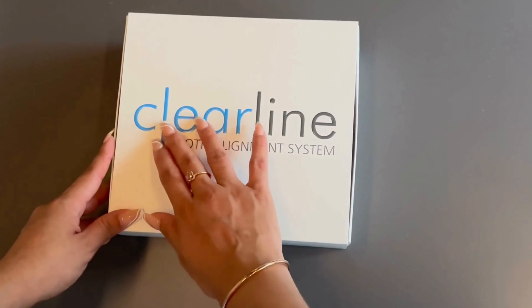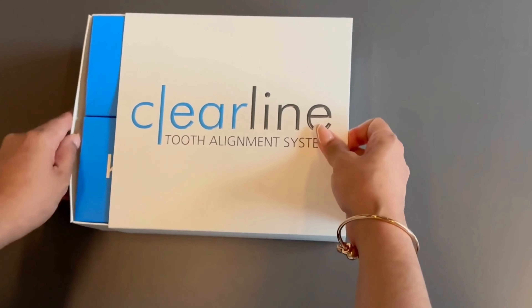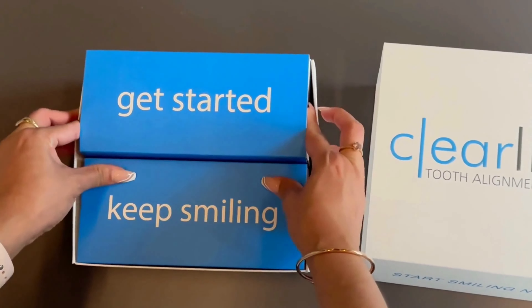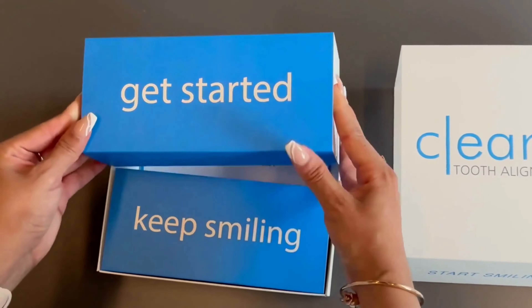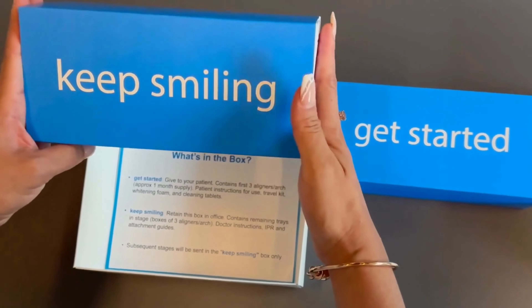Introducing the latest packaging for our Clearline Tooth Alignment System. When opening a new case of Clearline Aligners, you will find two boxes: one for your patient labeled Get Started, and one for the doctor marked Keep Smiling.